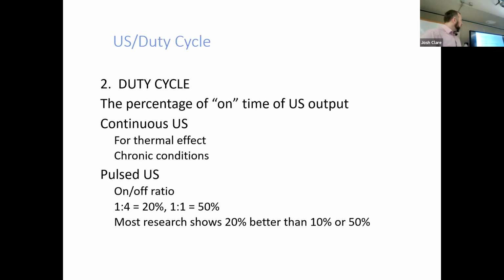The duty cycle is the percentage of on time. So just like with our diathermy, we could have continuous and it's always on, or we can have pulsed where the machine itself is flicking its on and off switch internally. So same thing for ultrasound. We can have a thermal setting, which would be the continuous setting, or we can have the non-thermal setting, which we're going to tell the machine, hey, flick your on and off switch really quick.